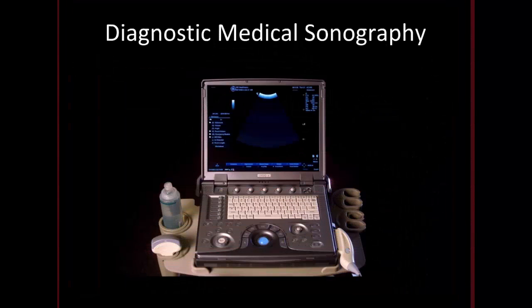Moving on to diagnostic medical sonography. This is a technique where we use ultrasound waves of a high frequency, as previously discussed, and an ultrasound transducer together with some ultrasound gel, where we can then send the sound waves through either mucous membranes or through the skin to visualize internal organs and all associated anatomical structures.